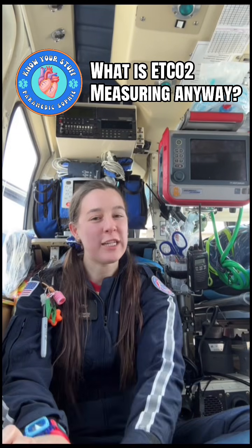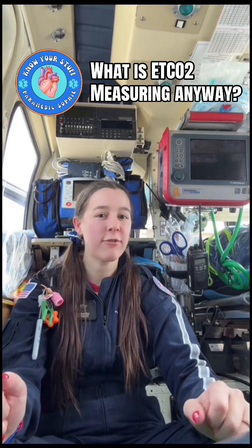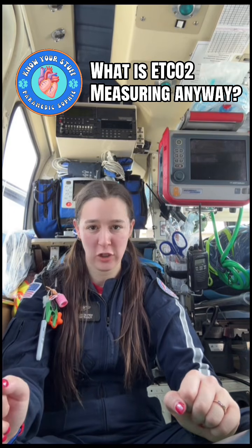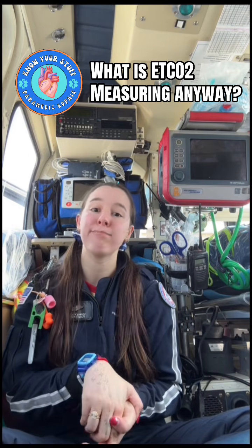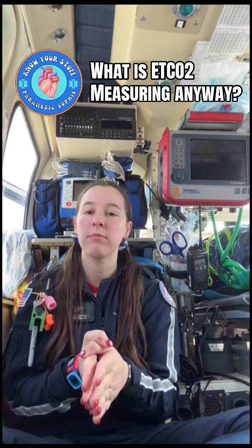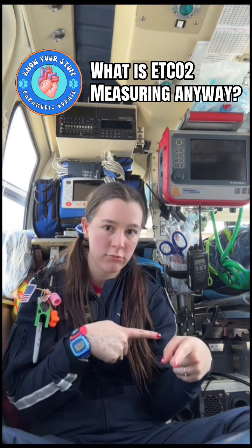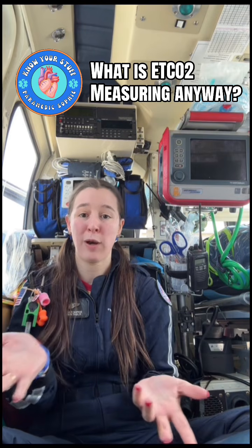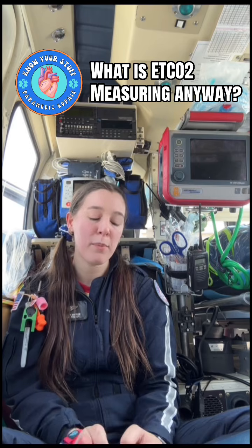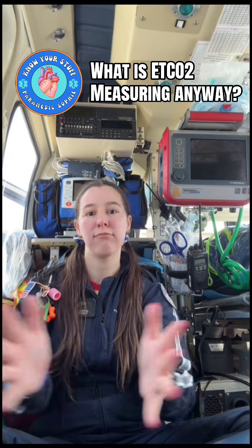We talk a lot about end-tidal CO2 like it is just a number on the monitor, but it's really a reflection of some beautiful physiology. End-tidal is the partial pressure of carbon dioxide at the end of an exhalation. So for that number to even show up, CO2 has to be produced at the cellular level, carried through the blood, and exchanged in the lungs and then exhaled. That's why it's so powerful, because it connects metabolism, perfusion, and ventilation all in one value. Why wouldn't you want to use it, right?